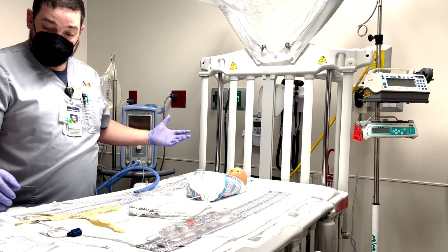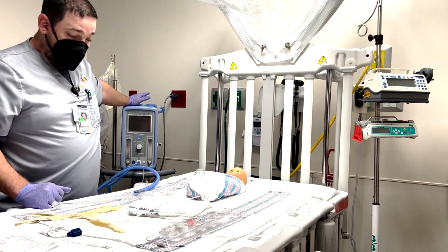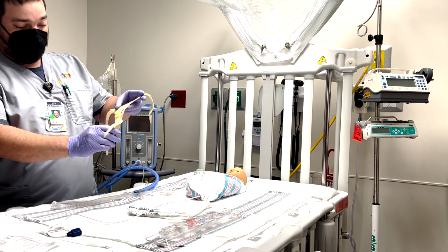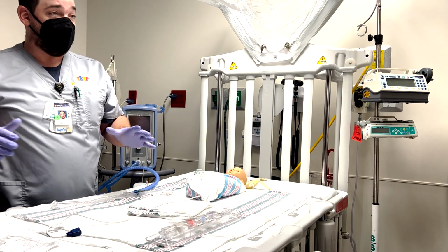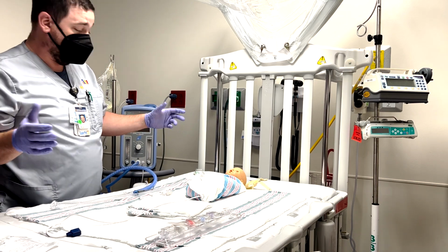So we've got our head circumference. RT has got the machine. This looks great. Okay. Looks like it's a medium. Kid's 33 centimeters. We take this spider-looking thing. Okay, now we're not doing this alone. I need a nurse at bedside because this is always easier when I've got two sets of hands, including my own.